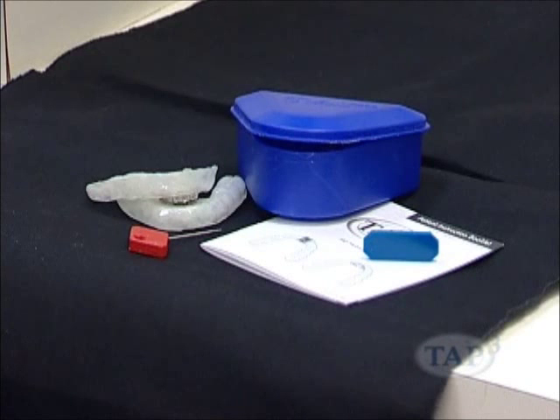This is an example of what to give the patient after delivering either the TAP TL or TAP Thermocryl. Send them home with a TAP appliance, the TAP storage case, the exercise bite tabs, and the patient instruction booklet.